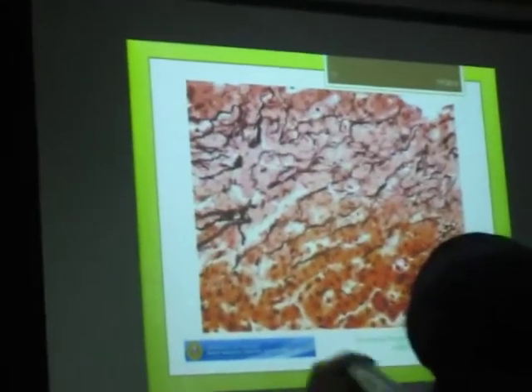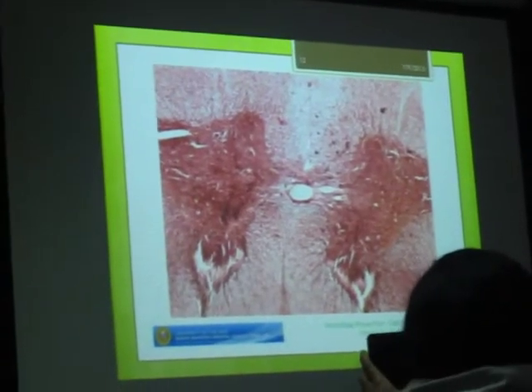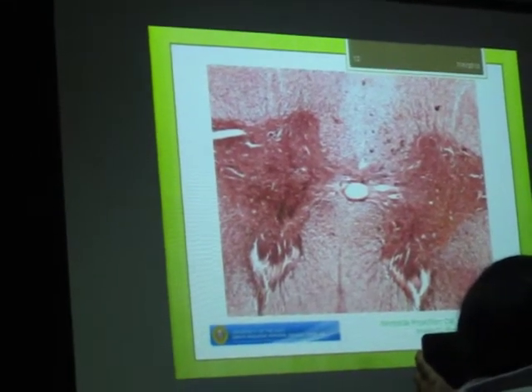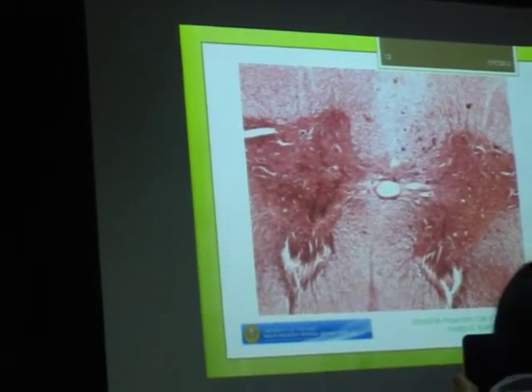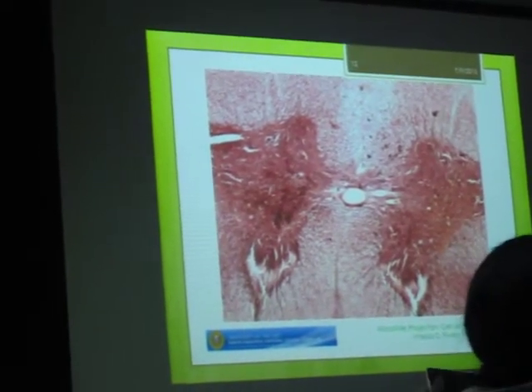Okay, so when you say reticular tissue, the predominant component is reticular fiber. Just like in elastic tissue, the predominating component is the elastic fiber.